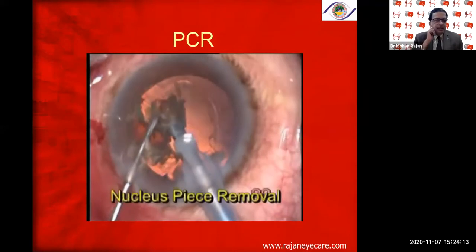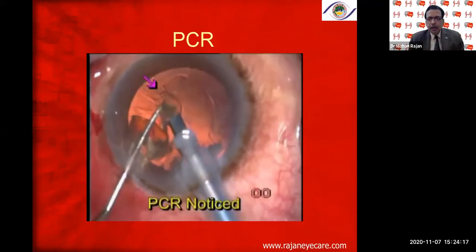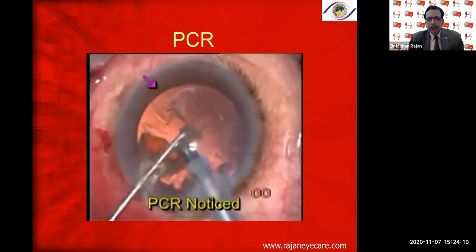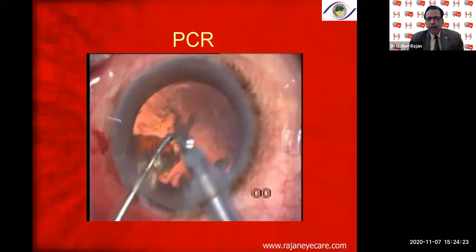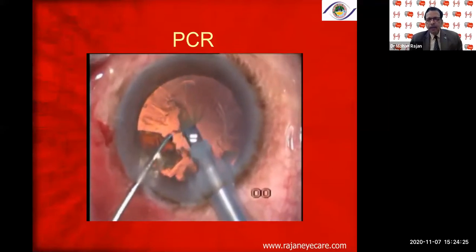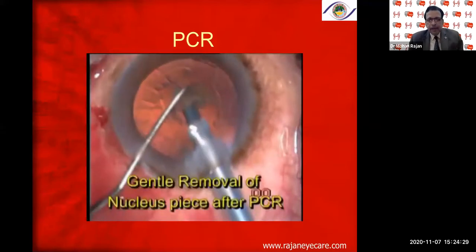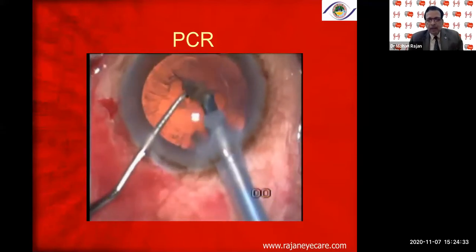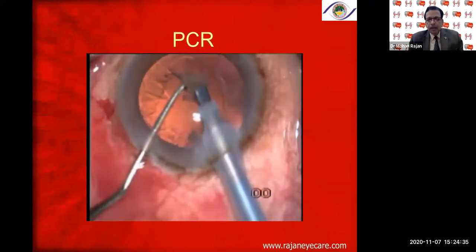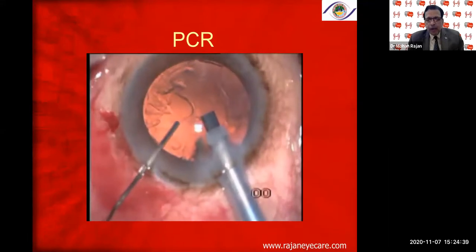You can see here, this is a PCR because of the surge. There's a small PCR in a dense brown cataract. Because I was using a second generation phaco machine, a long time back, this patient came to me and this PCR occurred. You can see here, I'm trying to remove that piece and there is a small PCR, which you can see just like a posterior capsular rhexis. But I didn't lose my calm.